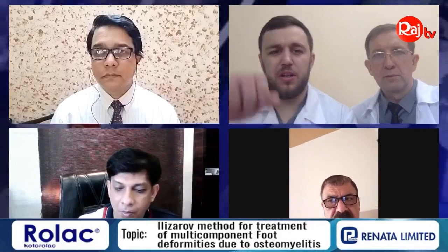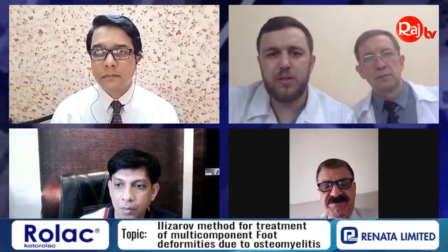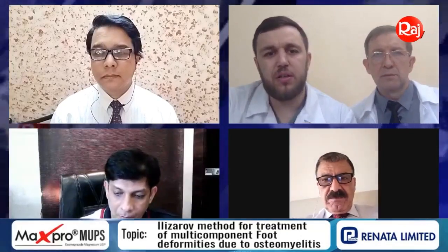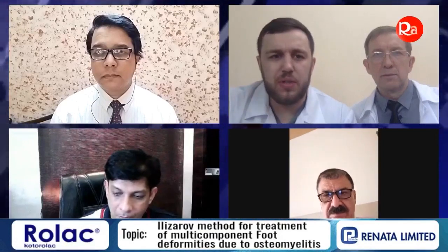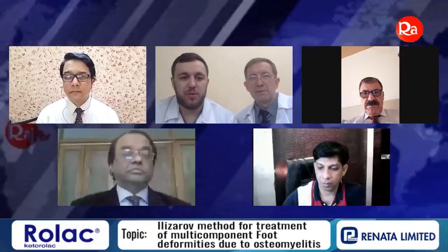But I think if we do it without eye control, not gradually, we can get some blood supply disorders of the skin flap, and from that, necrosis of the skin, local necrosis of the skin between the subskin implant, I mean. And something else like that. But in my practice, I haven't seen any troubles or mistakes with the technique.